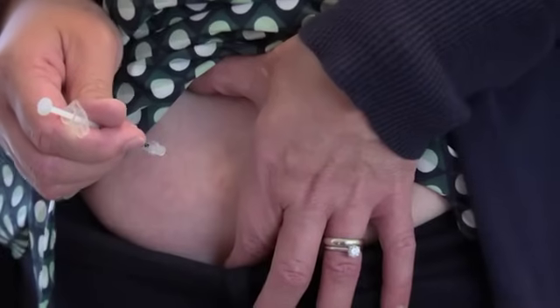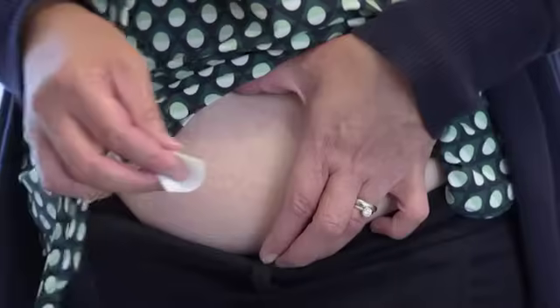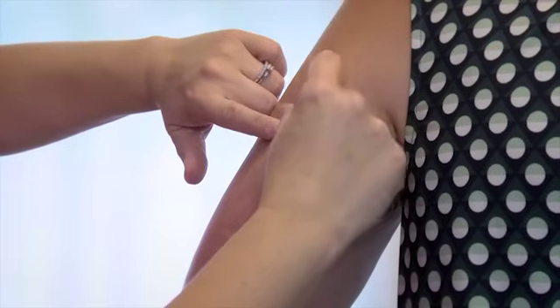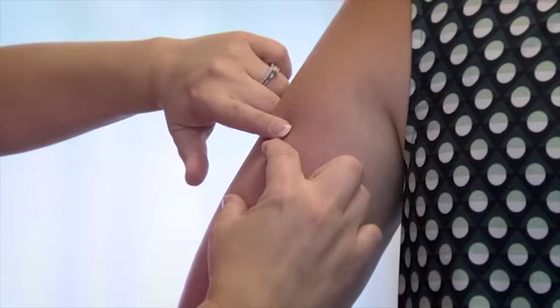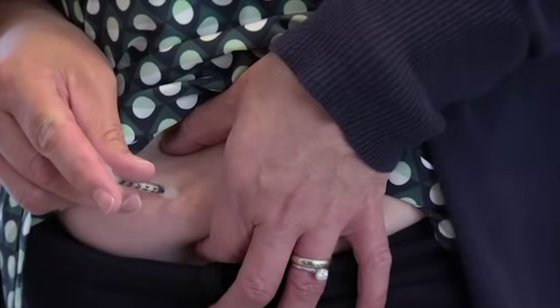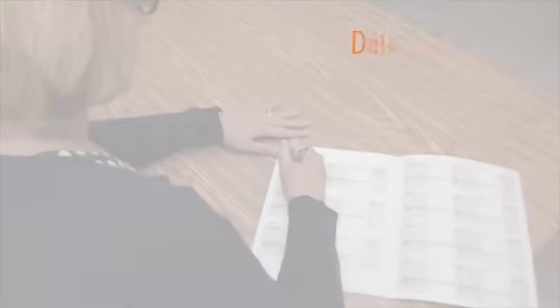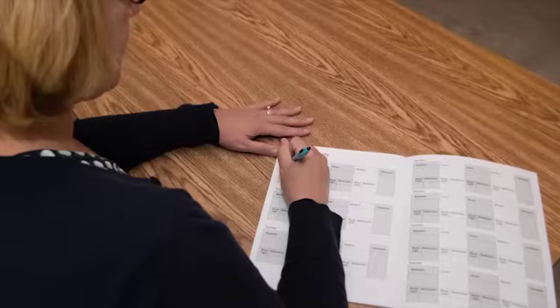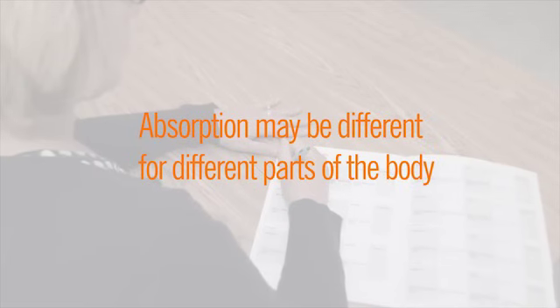Follow these guidelines: ask your healthcare provider which sites you should use. The injection site is about two inches of skin — clean this area in a circular motion with an alcohol wipe. Move the site of each injection; inject at least one and a half inches away from the last spot. Try to inject in the same general area of your body at the same time each day. Keep a record of which injection sites you have used. Note that depending on which type of insulin you are taking, absorption may differ for different parts of the body — talk to your healthcare provider to learn more.